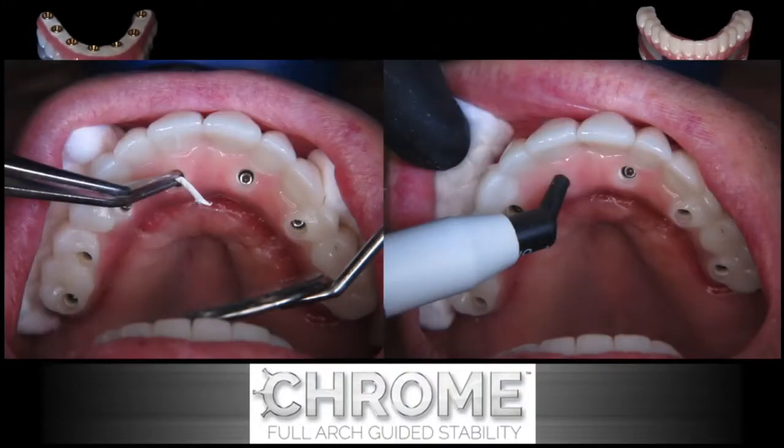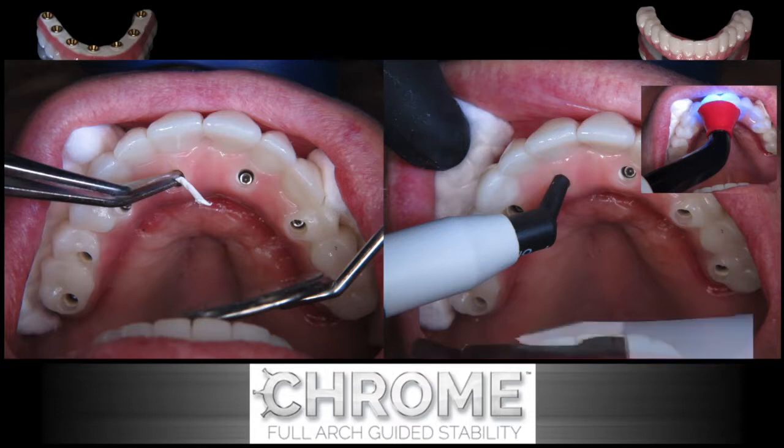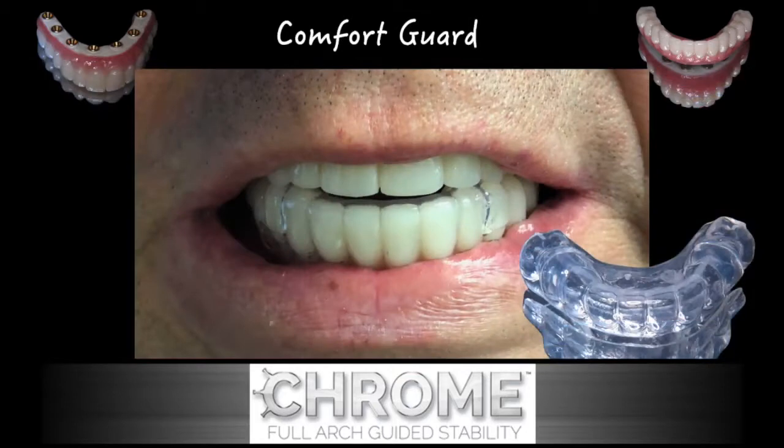The iJIG allows for an easy transfer. We're now going to plug up the screw access holes with PTFE tape and Telio onlay material or Fermit, so that there is a smooth surface for the screw access holes and the patient's tongue. It's critical that we also fabricate some sort of a night guard or comfort guard for the patient, and this is also a laboratory step.